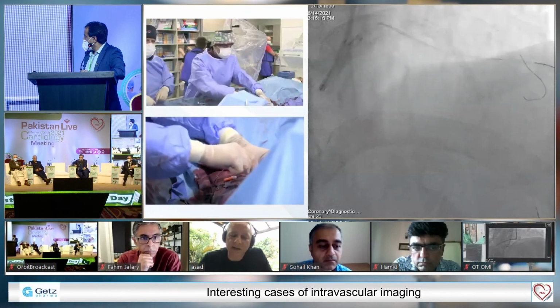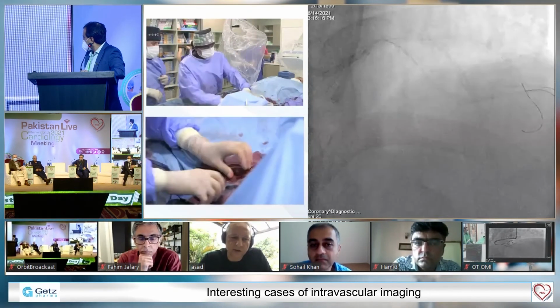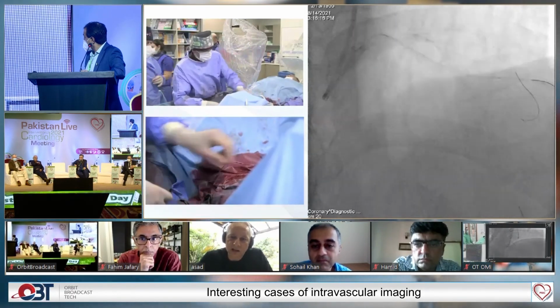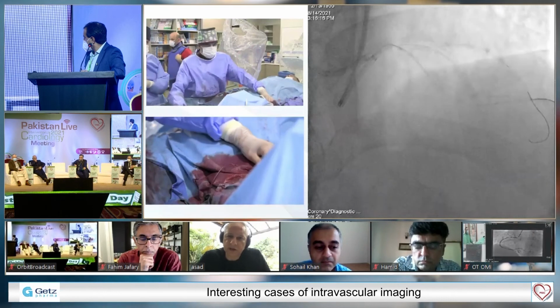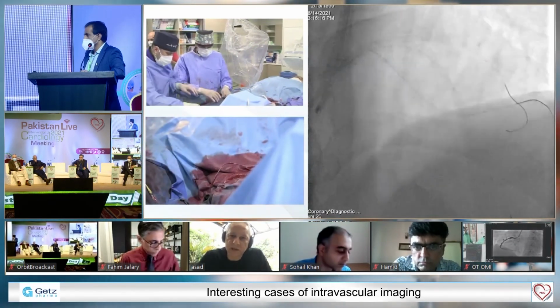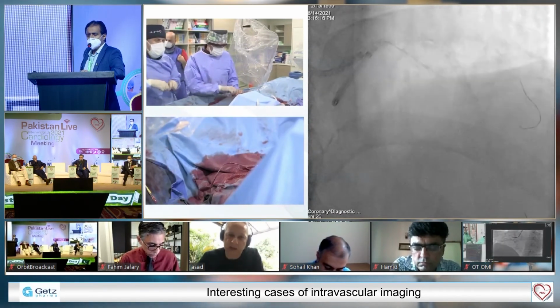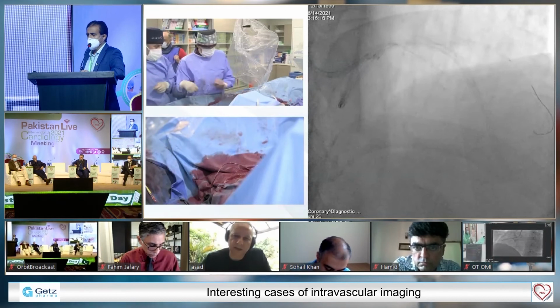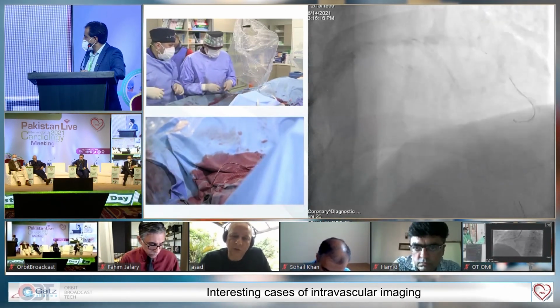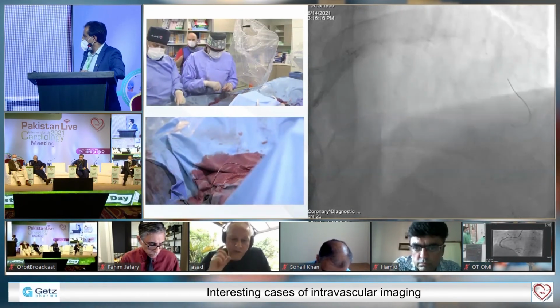I think since you talked about difficulty crossing, right from the beginning you need to have very supportive guides in there. And that's very key in retrograde cases, that you have aggressive supportive guides. So preferably an AL 0.75 in the right and XP or EBU large size in the left system. Plus 7 and 8 French guides give more support than 6 French guide. So that would be another reason for using them.